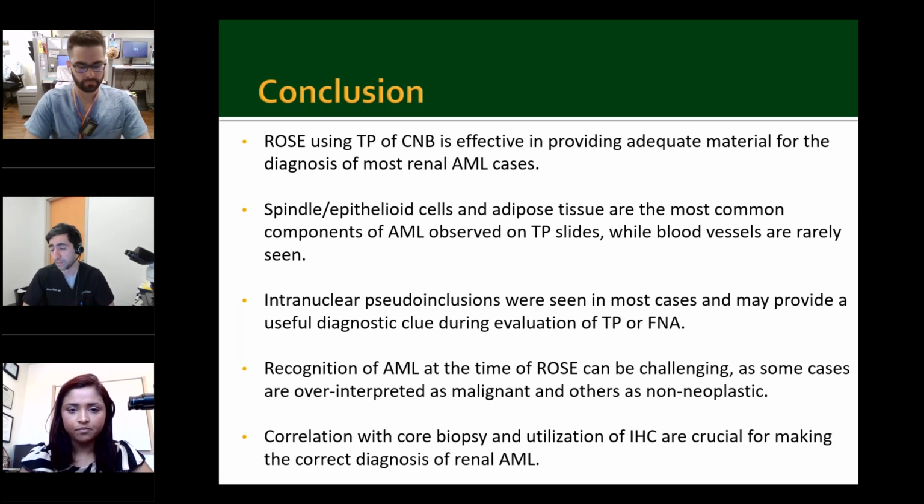presence of the spindle, epithelioid cells, and adipose tissue as the most common components observed on touch prep slides confirm the characteristic histological features of angiomyolipoma. However, blood vessels are rarely seen. Notably, the identification of intranuclear pseudo-inclusions in most cases provides a useful diagnostic clue.